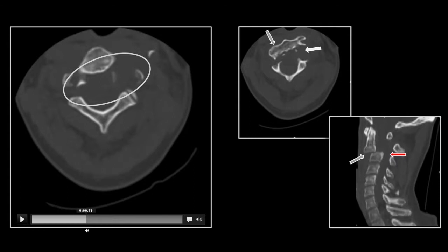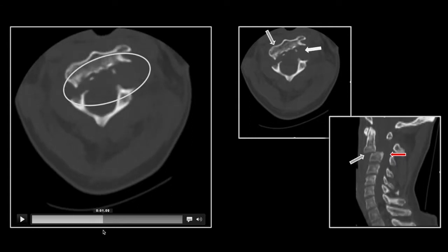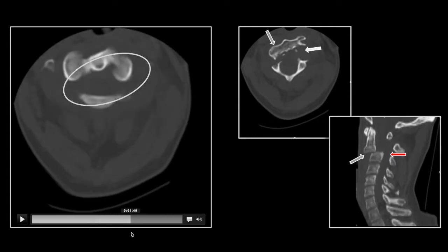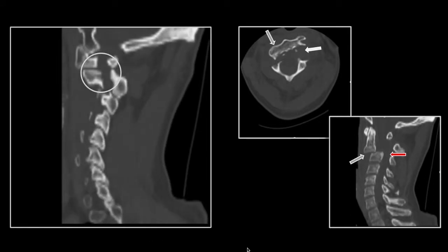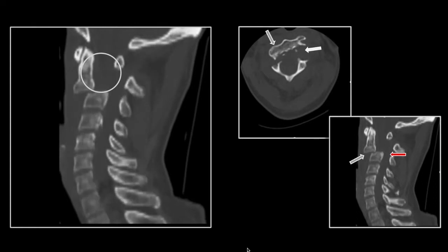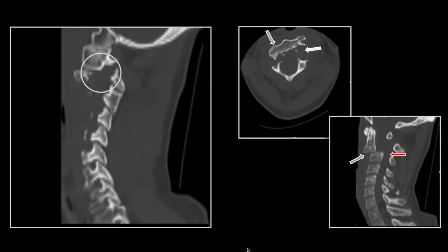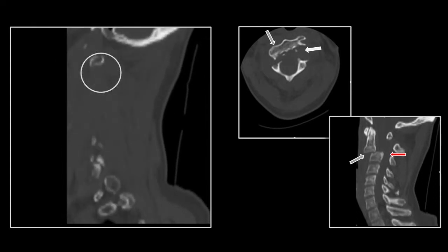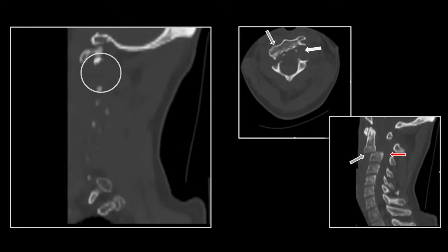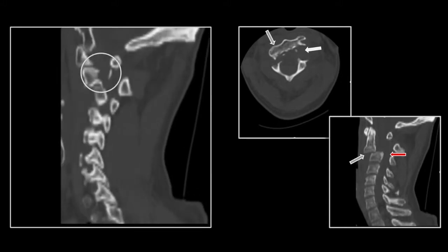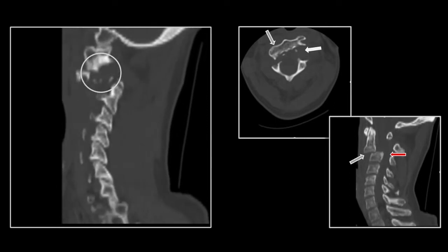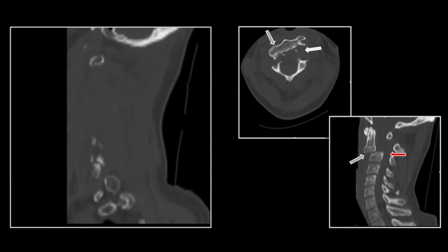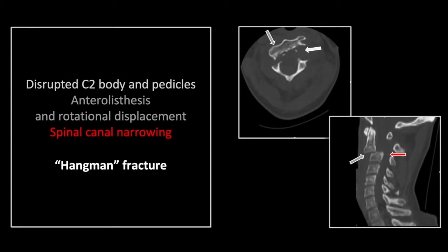There are the disrupted pedicles and the rotational anterior displacement of the C2 vertebral body. There is one pedicle and the other pedicle defect. You can appreciate that significant anterolysthesis. That is a classic Hangman fracture.